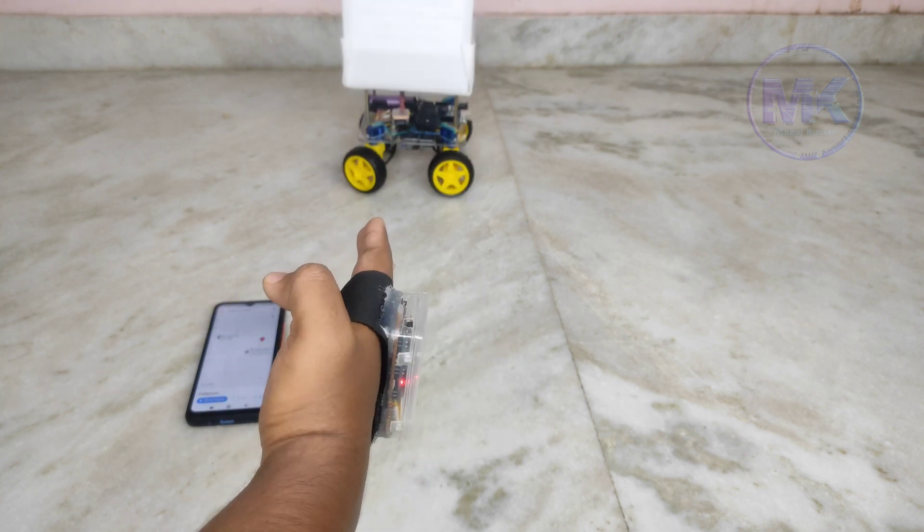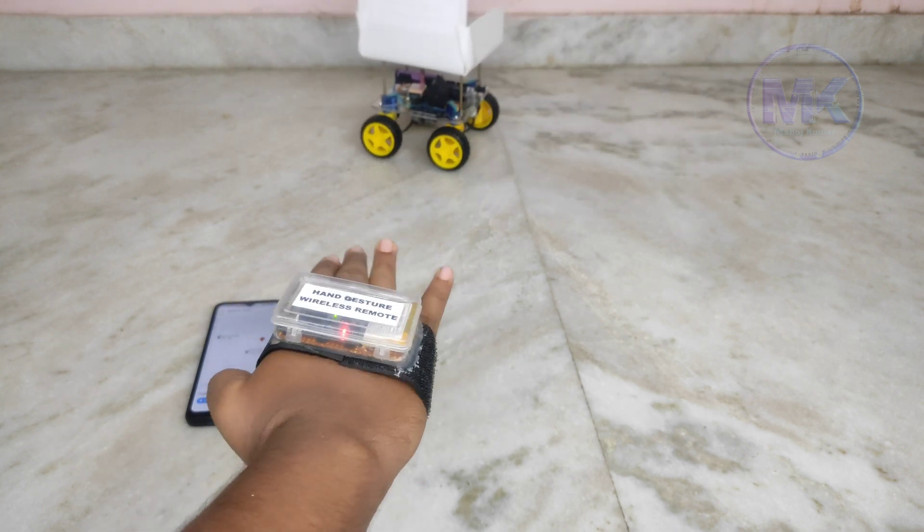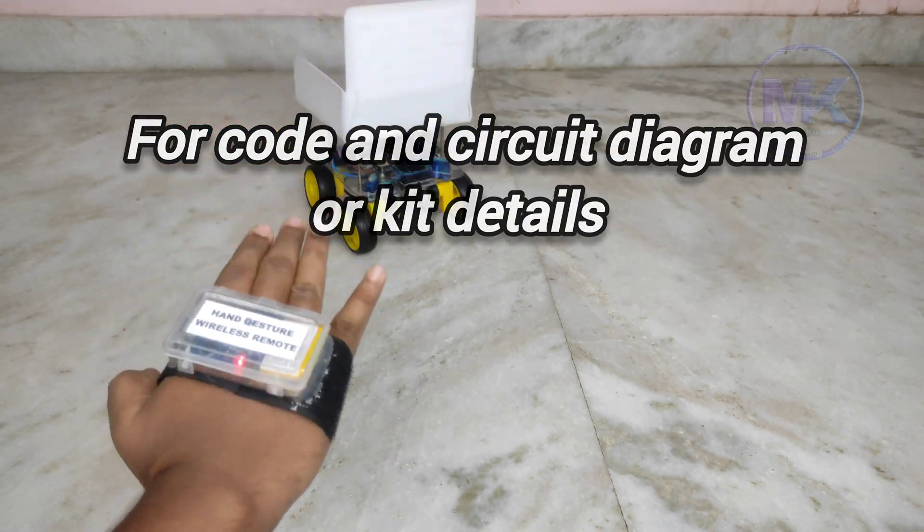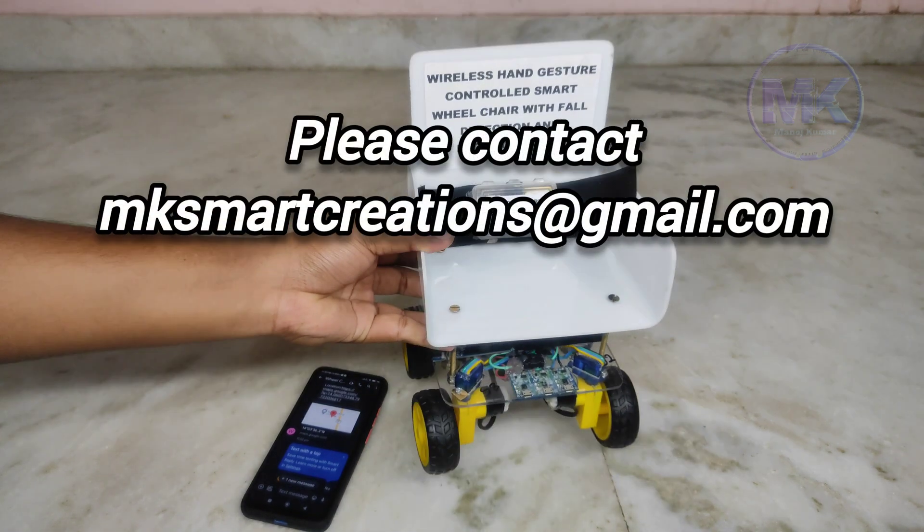This is the complete demo of this project. For code, circuit diagram, or kit details, please contact mksmartcreations at gmail.com.